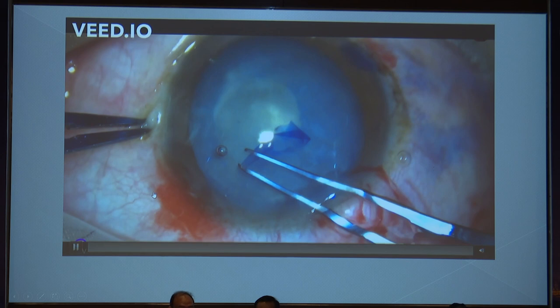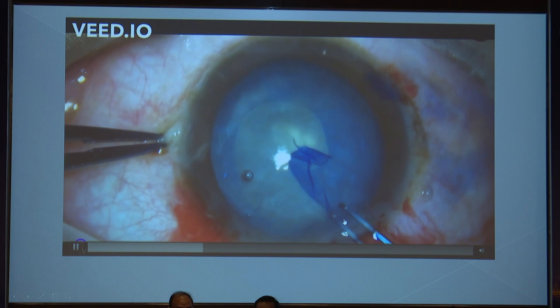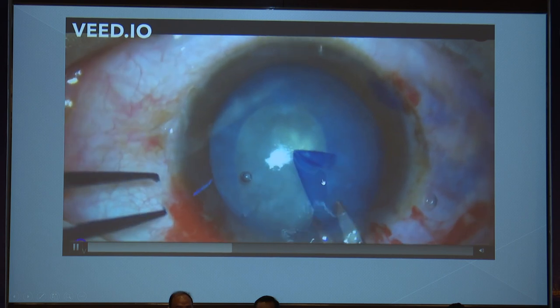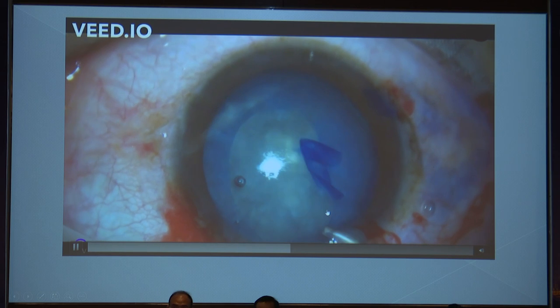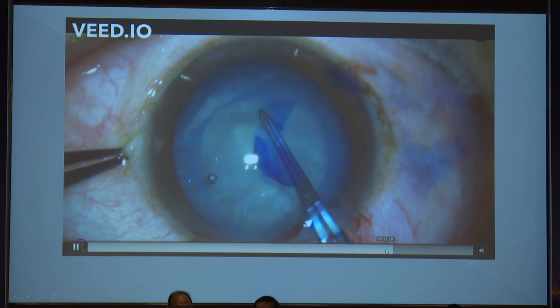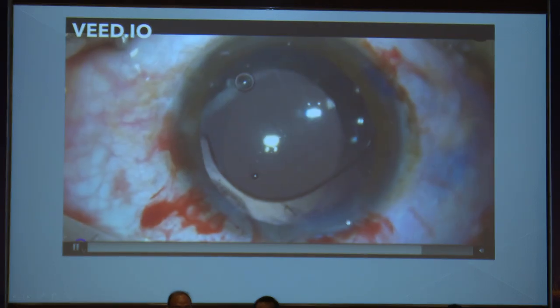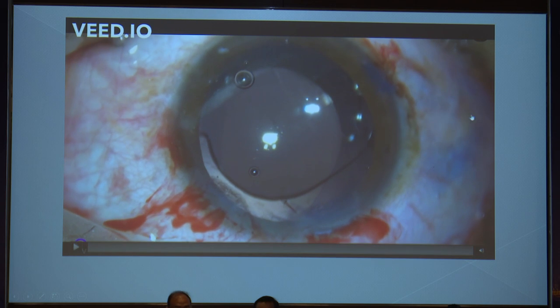A video with a mature cataract for better contrast here. Again, there's a runaway happening there. Unable to pull it to the center. Getting the Vannas to give the cut. The inner fold is then pulled over and the rexis is then completed. There will be some dehiscence there. You see that there. Make sure you implant your IOL with the haptics not in the area of the runoff, so that you are not putting any stress there. Perpendicular to it, you can implant your IOL.